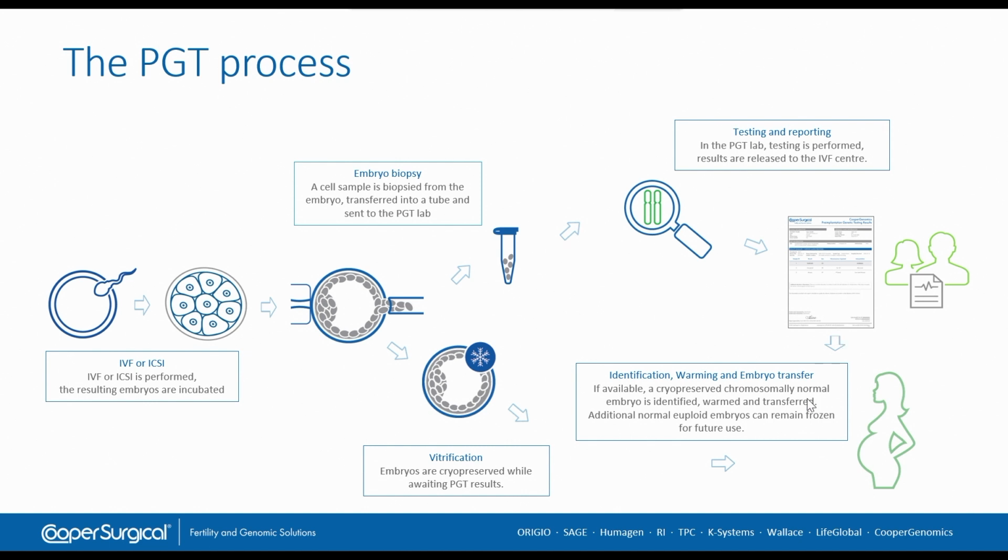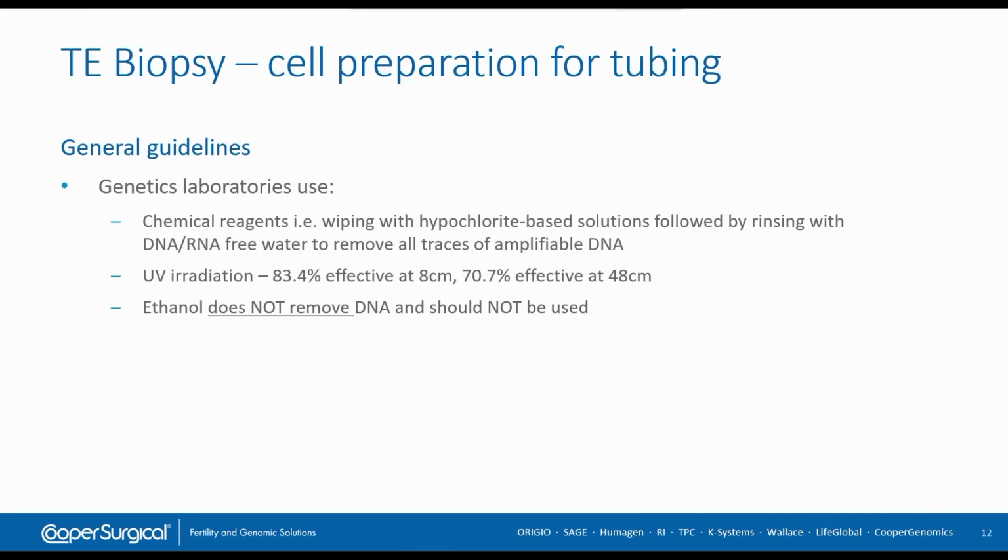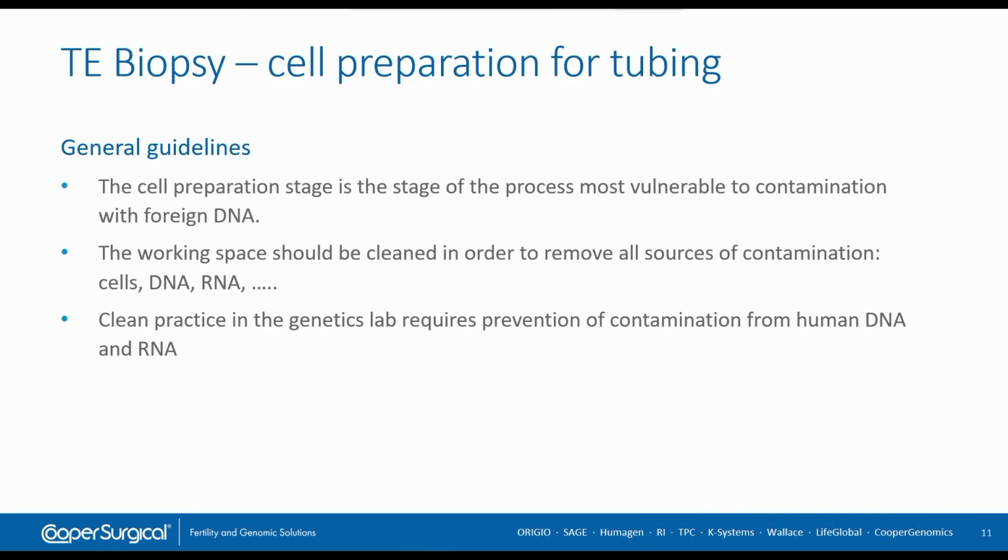And from this report, we will then be able to identify those embryos that are genetically healthy and those that we will then warm, culture and transfer to our patient. And hopefully this then will result in a healthy pregnancy. Now, today we are going to focus on the tubing process itself, and I will guide you through that process step by step. But first of all, we need to discuss the general guidelines for that.